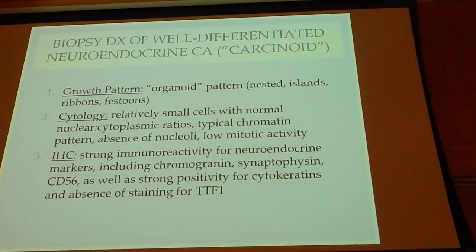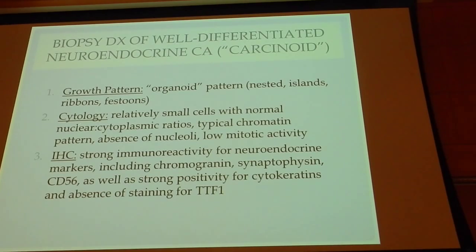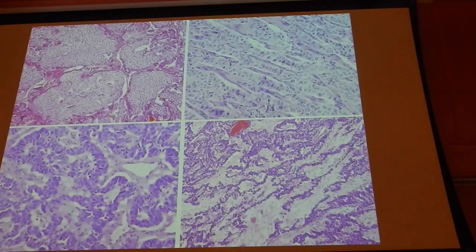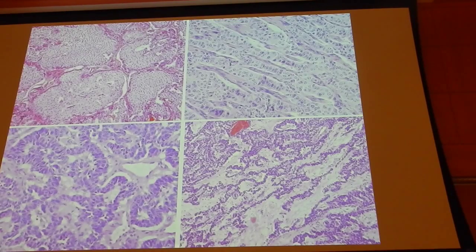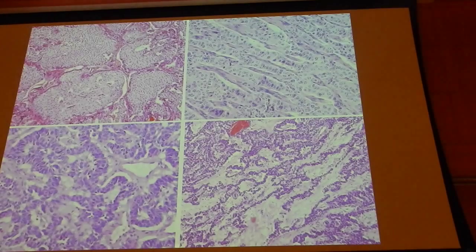For well-differentiated carcinoids, we expect a nice organoid pattern of nests, islands, ribbons, and festoons. Cells should be relatively small with normal nuclear-to-cytoplasmic ratios, salt-and-pepper chromatin, absence of nucleoli, low mitotic activity, and strong positivity for neuroendocrine markers. These are easy to diagnose on resection specimens. Here we see examples with nested, trabecular, and serpentine growth patterns.